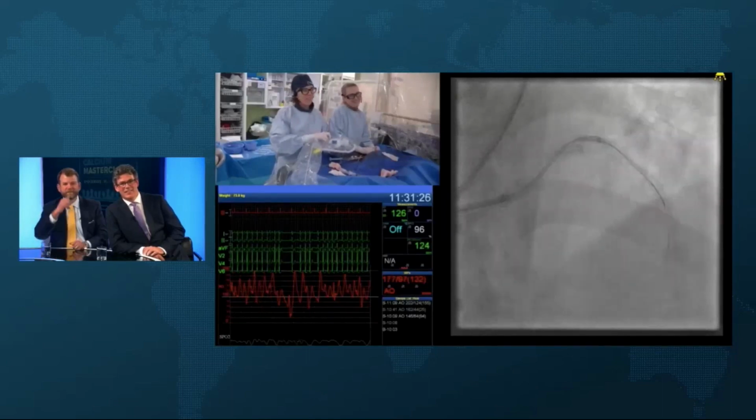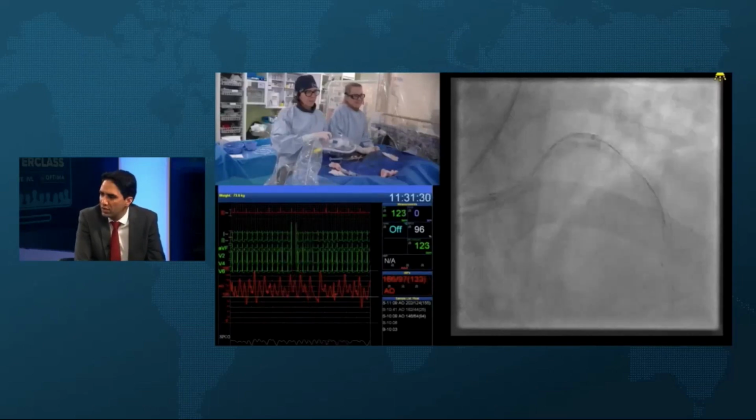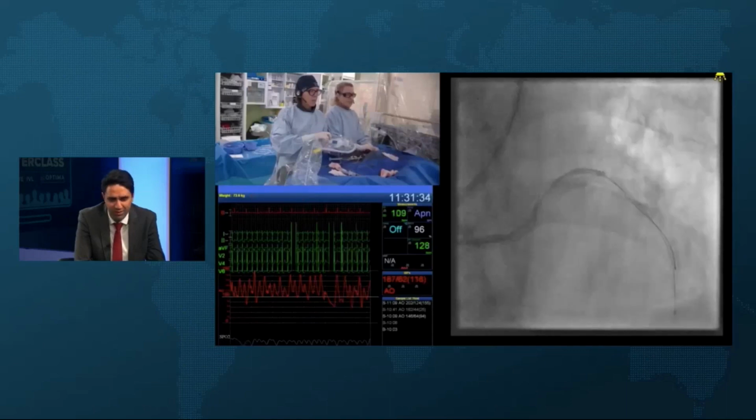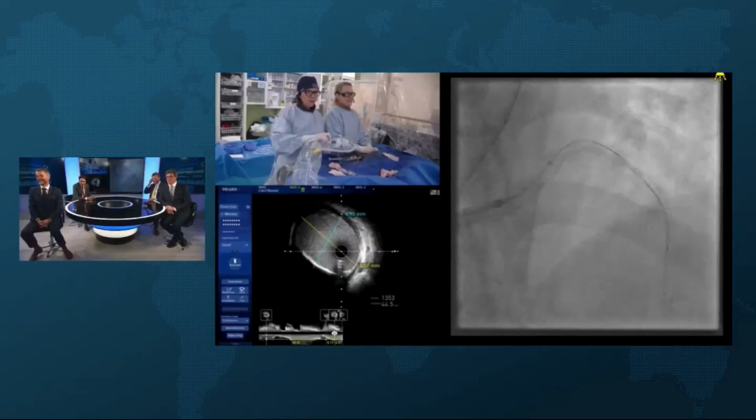So can we go live on what made you guys choose IVUS over OCT? Was it the GFR? Was it the patient age? And it might just be preference. You're making Ziad a bit upset, so if we could just talk about that. Let Claudia answer and then I'll tell you why for me.